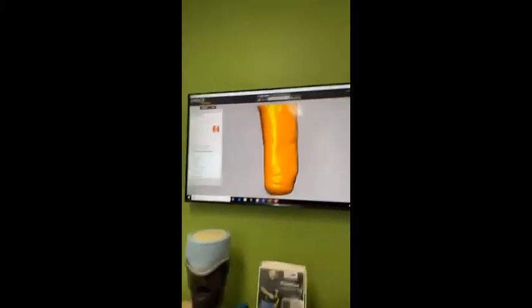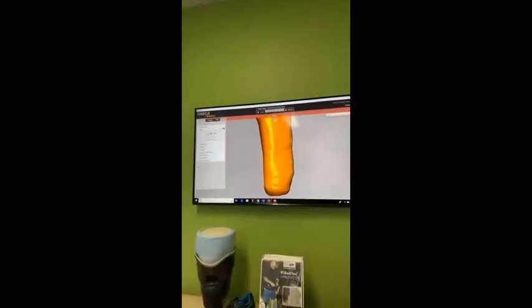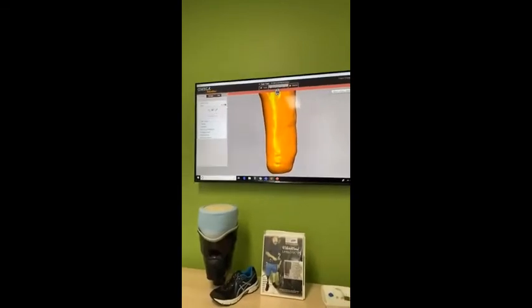So we bring in a file here. We can edit it. This one's been created before, so there's not much editing to do.